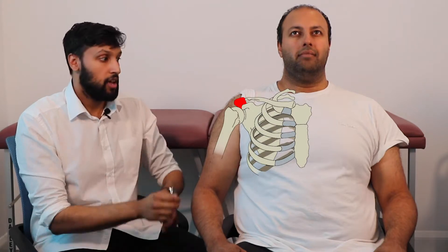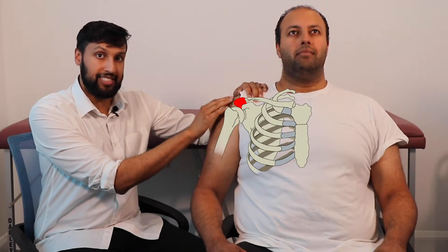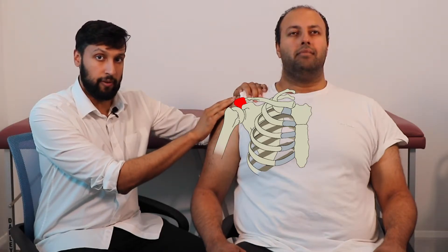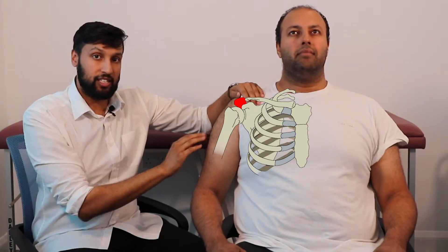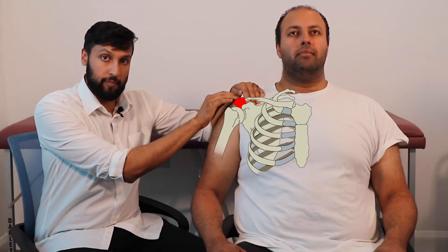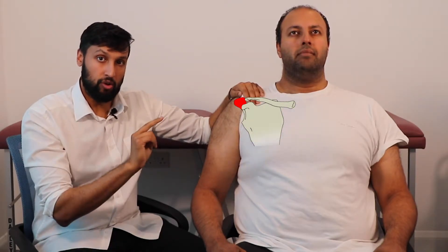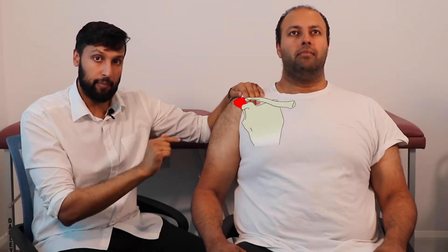In order to inject safely in the deltoid muscle it's very important to be able to identify two important landmarks. The first one is the acromion process. The acromion process is a bony projection that can be felt just before the curvature of the shoulder. By placing your hand just before the shoulder curves you're able to feel the acromion process, and two finger widths below we would mark out as the upper border.